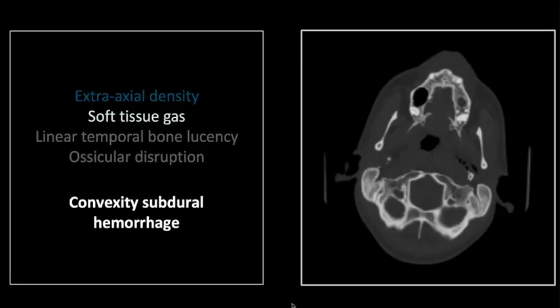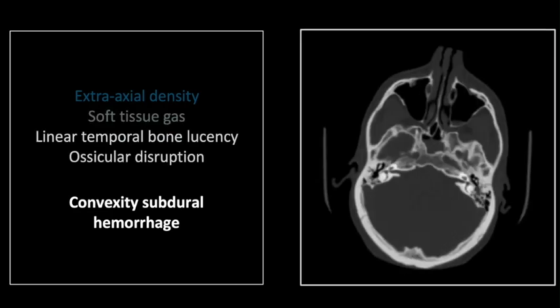The more important finding here is actually this one. There is soft tissue gas at the skull base, suggesting either a soft tissue laceration or a skull fracture with communication to the sinuses. There is a linear lucency, a hypodensity, in the petrous portion of the temporal bone. This is what's known as a longitudinal fracture along the long axis of the petrous portion of the temporal bone, as opposed to a transverse.